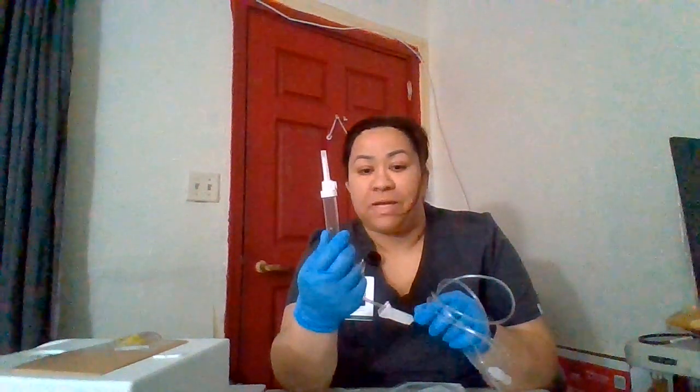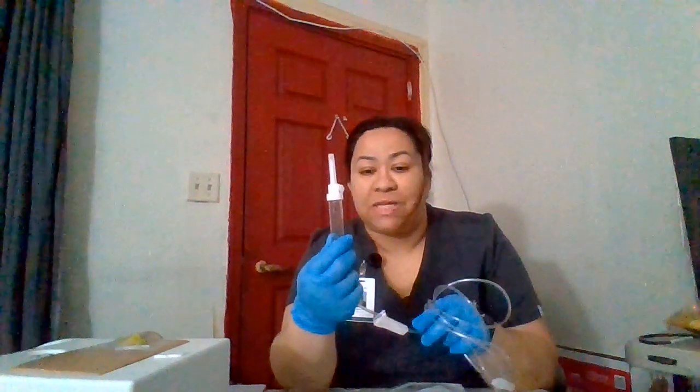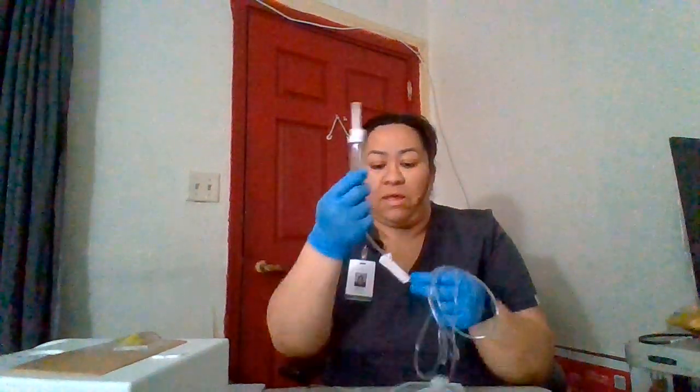Then we have our drip chamber. The drip chamber is meant to avoid any air going into the line, into the tubing, and also to visualize our flow rate. So we will be able to check how many drops per minute we have here.